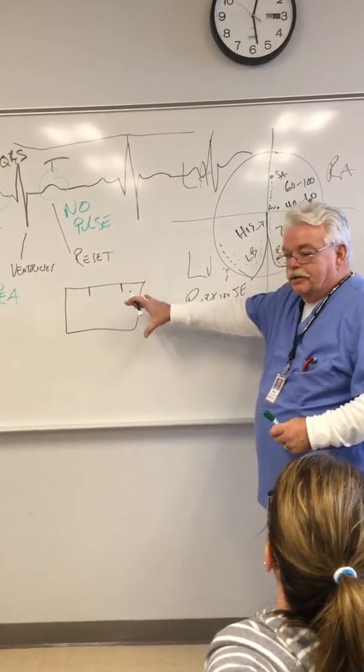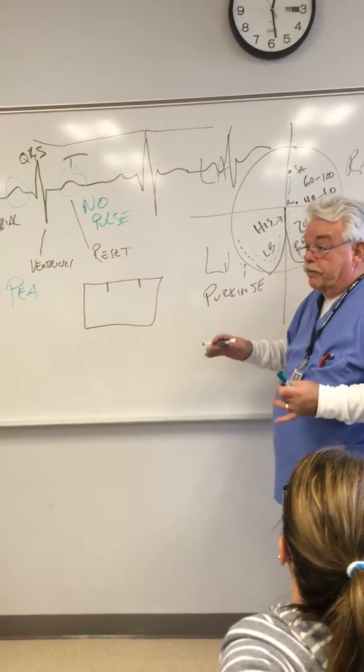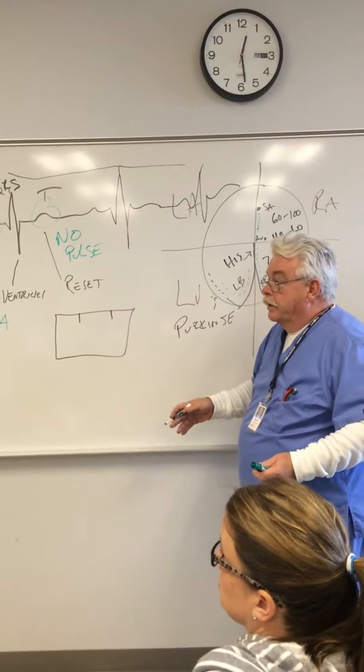This is only going to work if it's a regular rhythm. If this doesn't work, you have something wrong. You have an irregular rhythm, and I'm going to get into that in a second. So everyone understands normal sinus rhythm, sinus tach, sinus bradycardia.